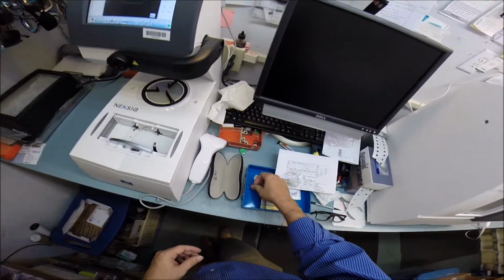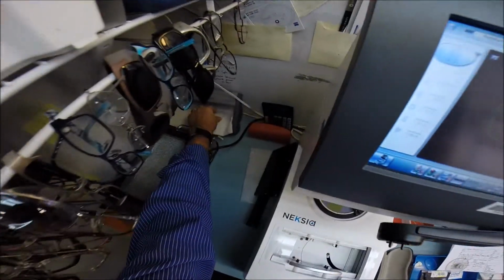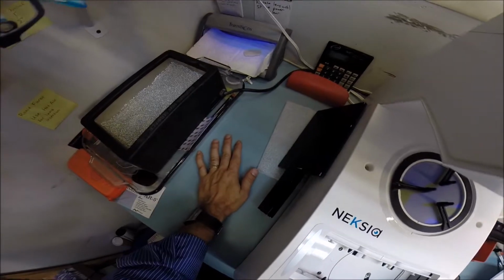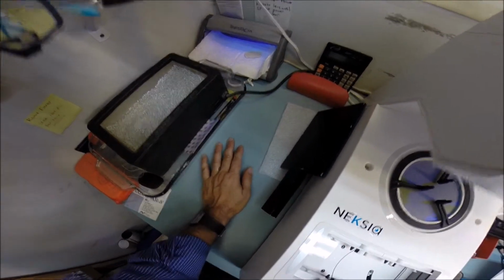Now, I wonder if your old lenses have transitions. Let me take one that is actually clear now. I'm going to put it in my little transitions unit and turn the light on, which is a strong UV light. And if your lens had transition, it would start darkening now. We're going to do this for yours in just a moment, but it has stayed clear, so you don't have transitions in your old lenses.